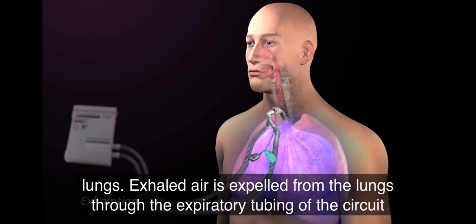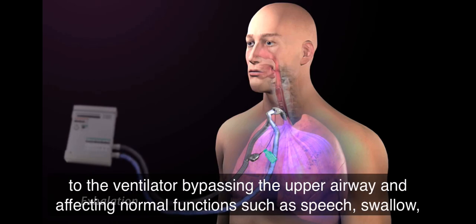Exhaled air is expelled from the lungs through the expiratory tubing of the circuit to the ventilator, bypassing the upper airway and affecting normal functions such as speech, swallow, and cough.